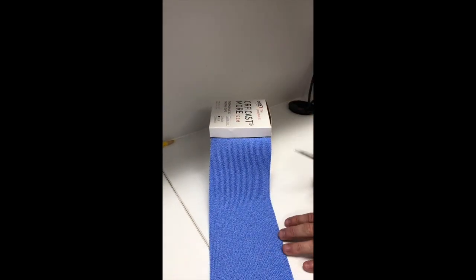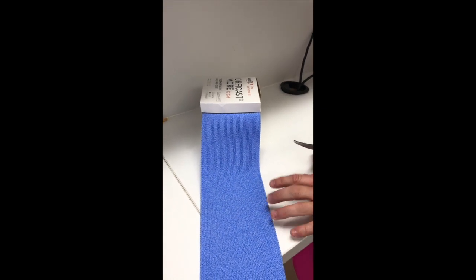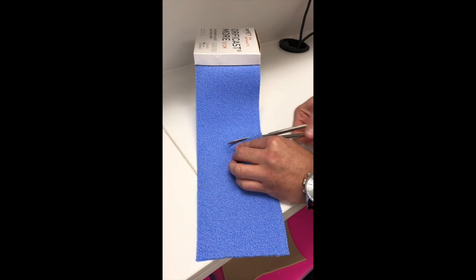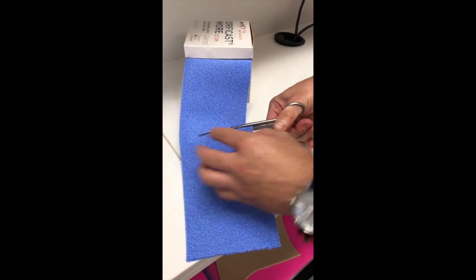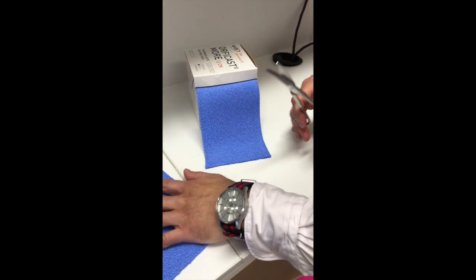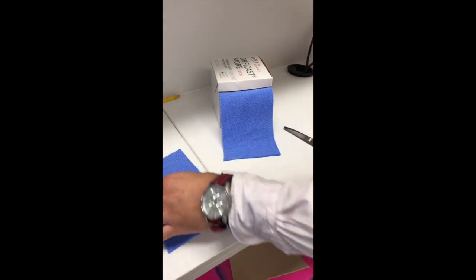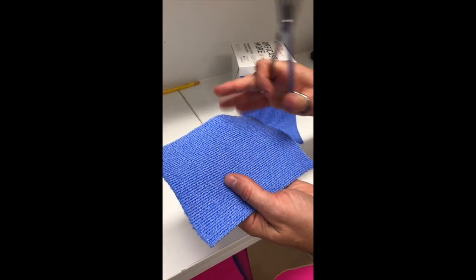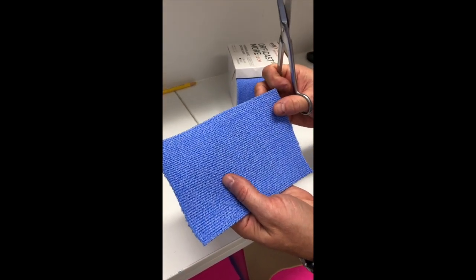We're going to make a hand-based thumb spiker today, so we need approximately 18 centimetres of our material. It's quite easy to cut before it's been heated. It's quite soft — a textile material that's woven and impregnated with thermoplastic.